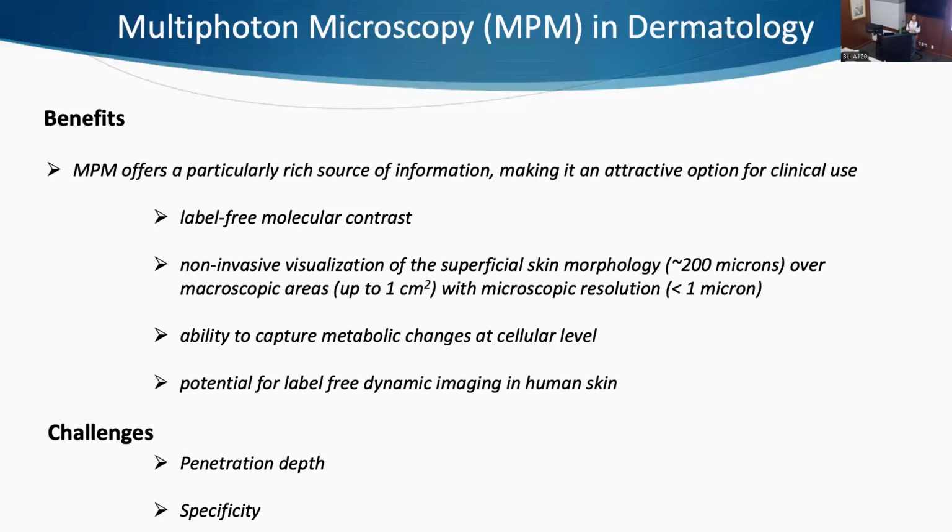So you showed a previous example with, I think, principal component analysis that you used to decompose the image into the different skin components, right?